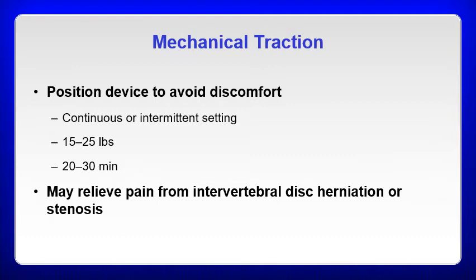Again, 30 on, 30 off. Sometimes narrowing down the structure is a little tough. You can start with 30 seconds on, 30 seconds off.